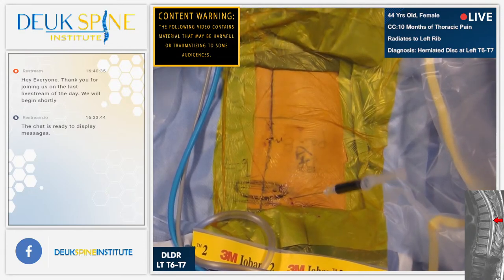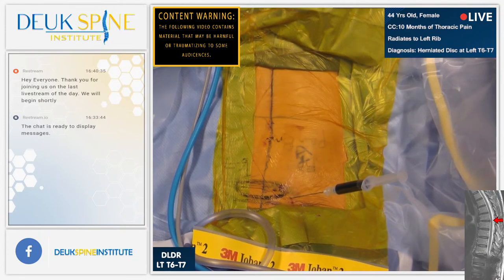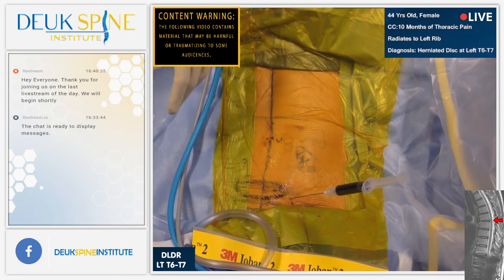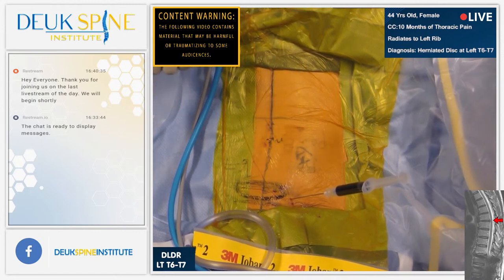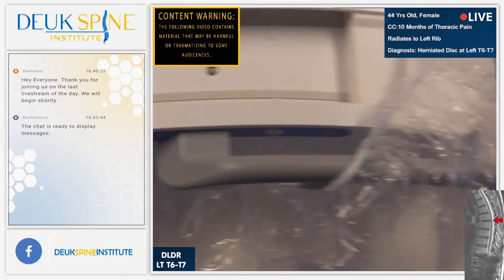Let's get an AP view. Hello. And give her another minute. Hi, my friend. Can you open your eyes for me? We're going to check the position of the needle tip relative to the middle of the disc. Remember, this is a transforaminal surgery.